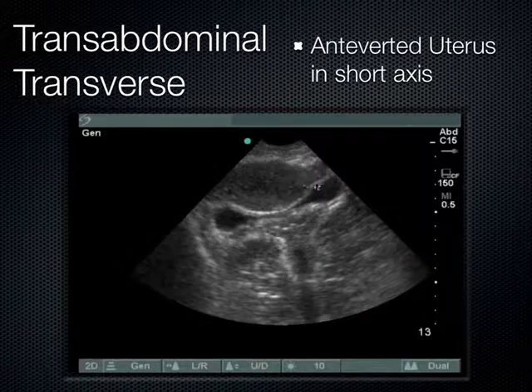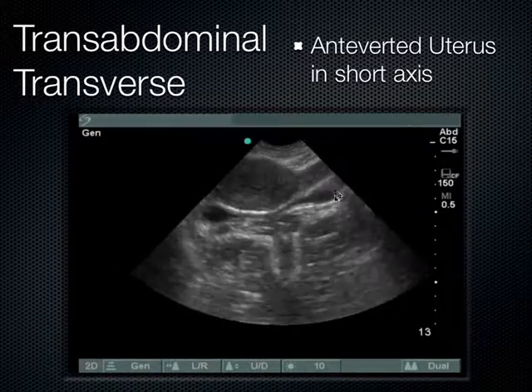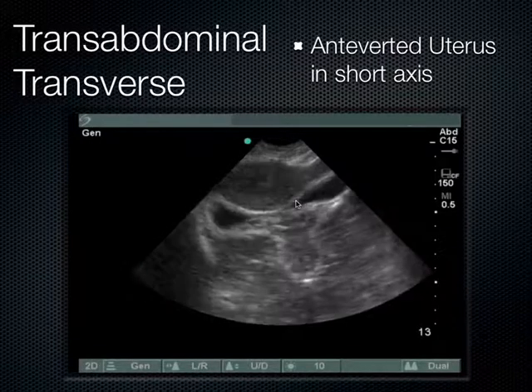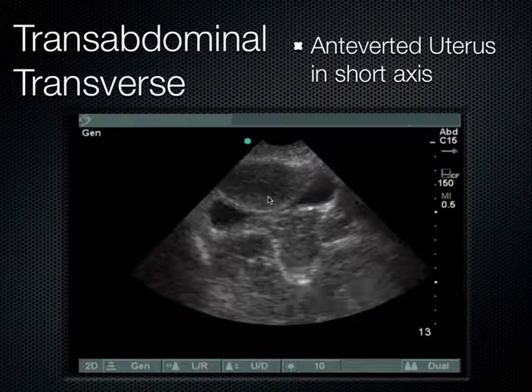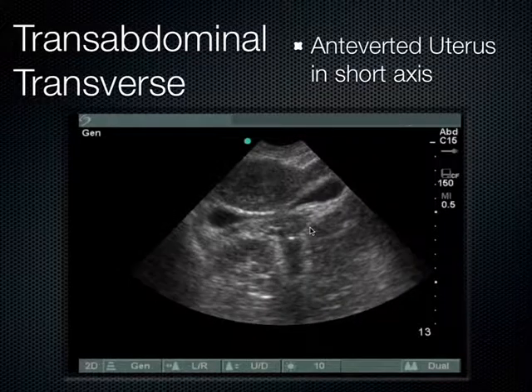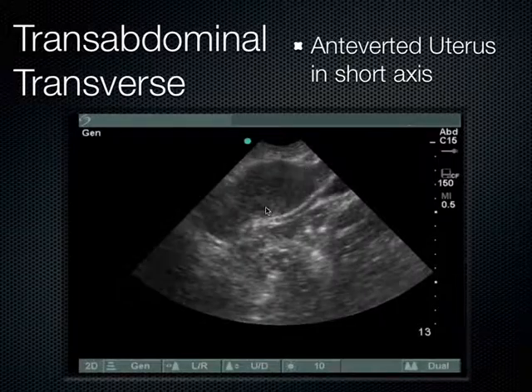But when the bladder is not full, when it's rather empty, here we can see this bladder is not very full at all. In fact, it's got very few cc's left in it. Now we can see that the uterus is actually on top of the bladder. So what happened was, this is the vaginal stripe, and then the uterus went out behind the computer screen and then came back at you in a transverse view. This would be the fundus of the uterus up here.